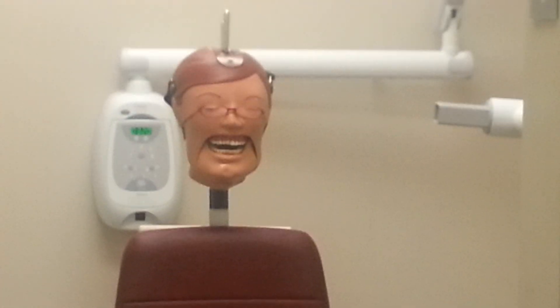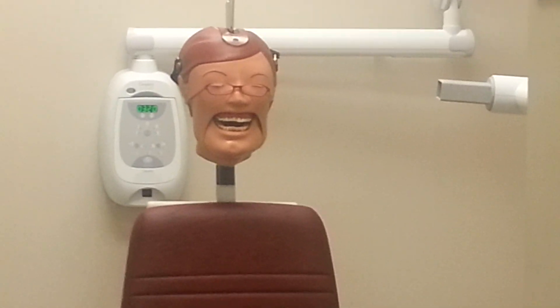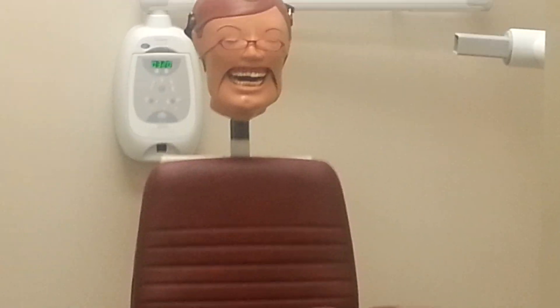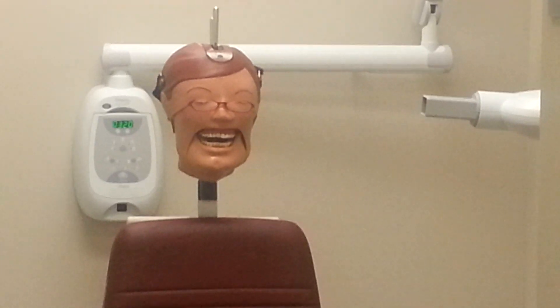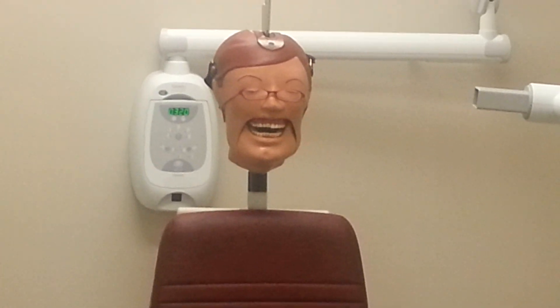Today we will be demonstrating proper radiographic technique for the molar bitewing. The bitewing radiograph captures both the mandibular and maxillary crowns in one image. It is primarily used for detecting interproximal caries and determining bone levels. The molar bitewing should capture the two distal-most molars in the mouth, as well as two millimeters of bone distal to the most distal molar.